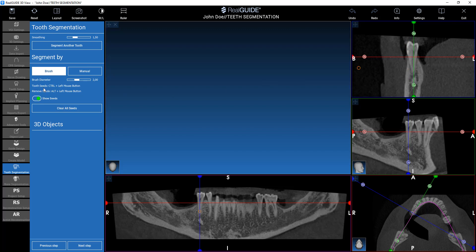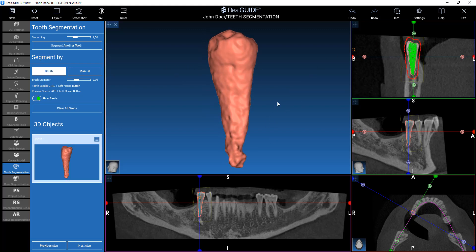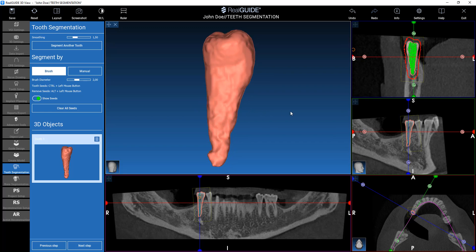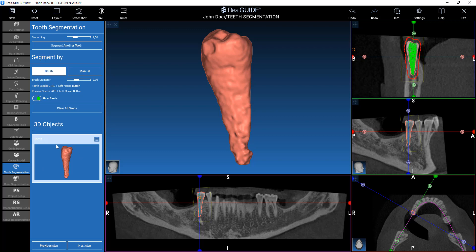In order to start the selection process, we are using CTRL and left mouse button. So keeping CTRL pressed, we outline the tooth like this. As soon as I remove the finger from the mouse, I have a startup segmentation performed by the software and a new object is then saved in my list.